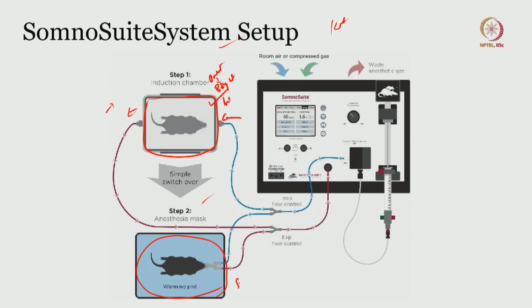So everywhere you see there is an outlet provided whenever there is an inlet. It does the scavenging, and this is the scavenger board, a system where the extra anesthetic gases are removed from the circulation and let out as waste. Okay, and it uses room air to create and maintain the flow rate. That is in a nutshell how the anesthetic flow works. And before that, obviously you will be loading the drug into the syringe, which is digitally driven with a precise set flow rate. All right.